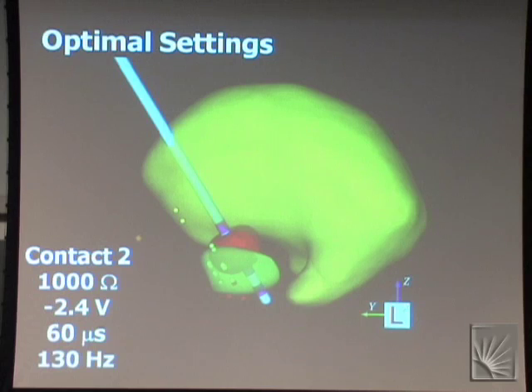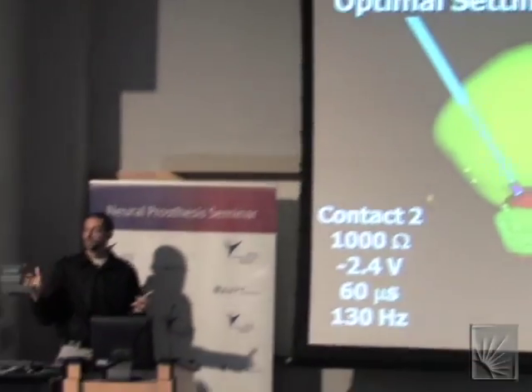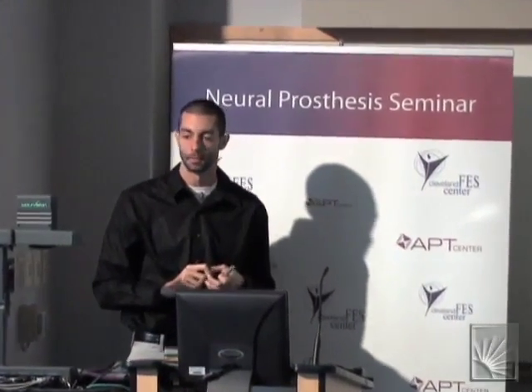We've also looked at, retrospectively, which track or how many tracks were necessary to get to the point where the brain atlas didn't really move around anymore. Where was the limit, so to speak, in terms of constraining it? And that was in that transition from about 3 to 4 tracks. Yeah. So once you've got 3 tracks, that's about as much information as you're going to get in terms of constraining the system.